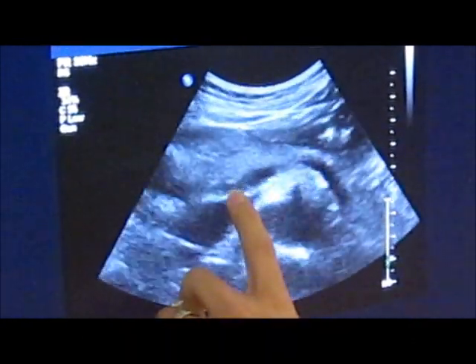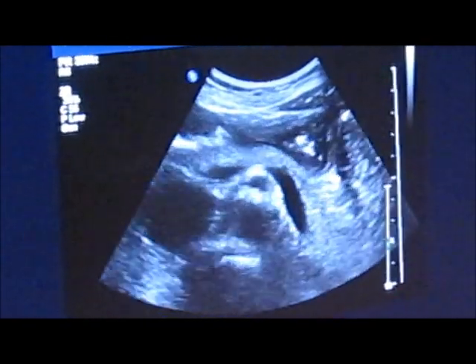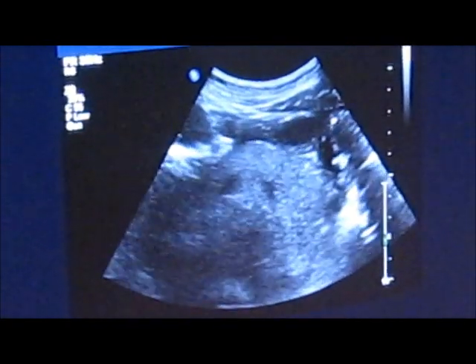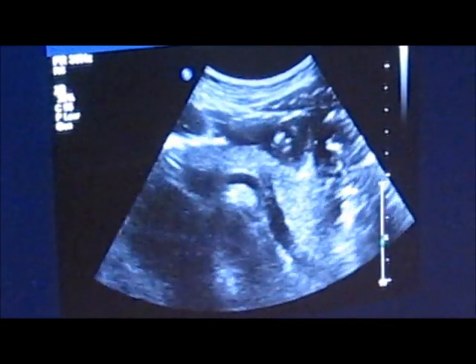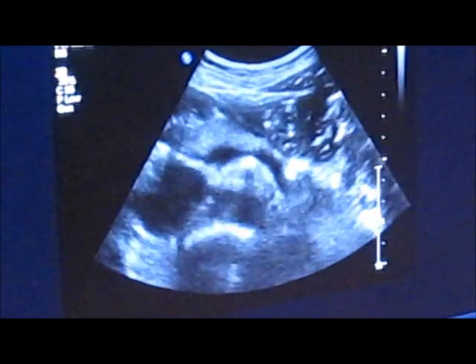So this is the head of the pancreas. This is the body. And then this is the tail. Down through here. If you see this bubbling stuff right here, this is part of her stomach. So she has food in her stomach.